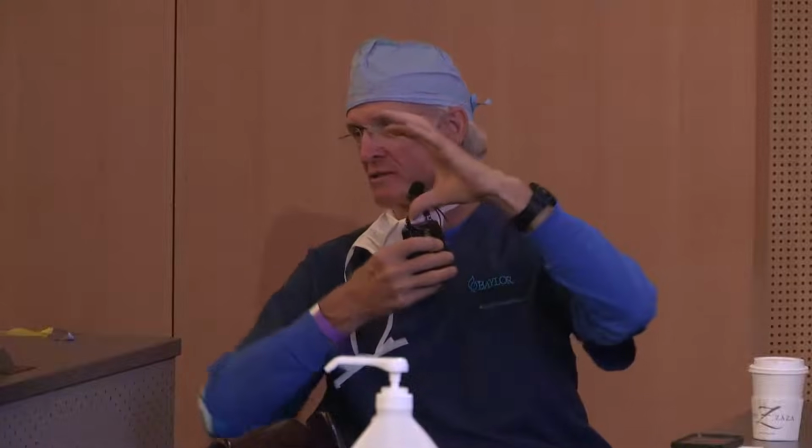So I usually, frankly, don't take the balloon off the wire on initial angioplasty. I may have to pull it out of the sheath just because you don't have enough space to inject contrast, especially with a recently dilated balloon, because it doesn't fold up to its original diameter. Or you can just pull it back far enough to get it out of the sheath, shoot your contrast, see extrav, put it back in, inflate the balloon, no problem.